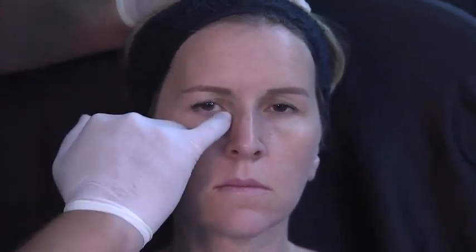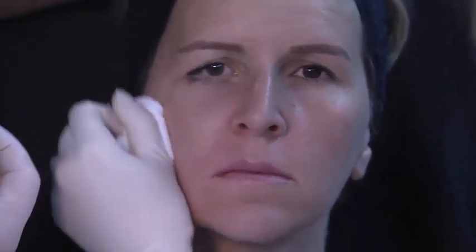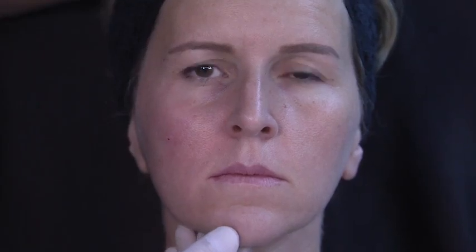Okay. Now, if I have a little bit more budget, imagine that she wants to improve the tear trough a little bit. I only need 0.1 or 0.2 in this area. Because she's young, the product that I'm going to use in this case is going to be Refine, the old classic. She has a good thickness of skin for a young patient in this area, although we know this is thin skin, but she's younger than other patients we can have in our clinics, and that's the reason why my product of choice is going to be Restylane Refine.